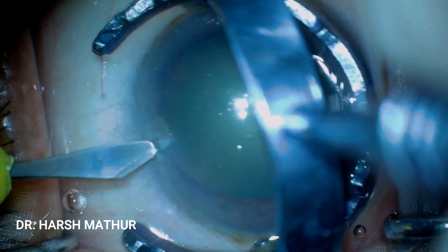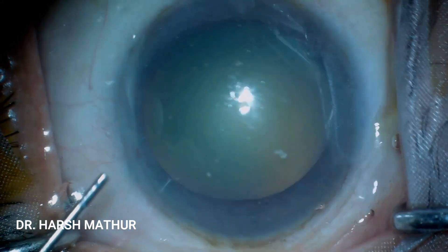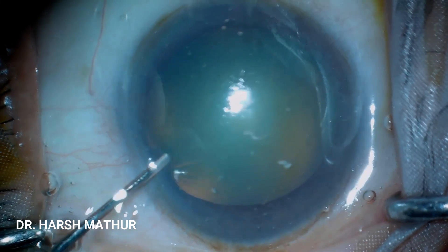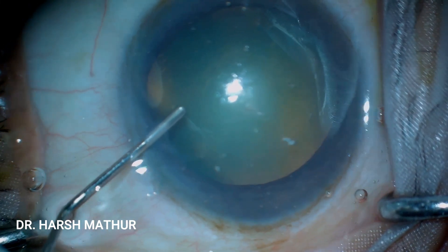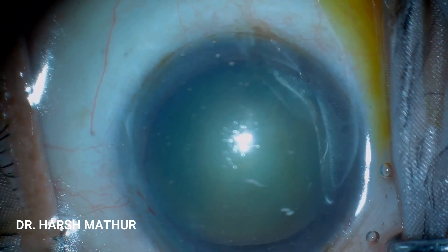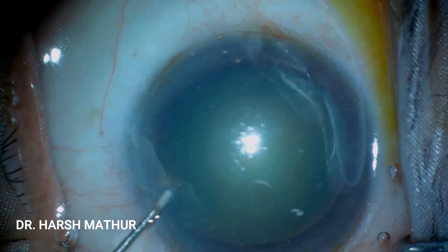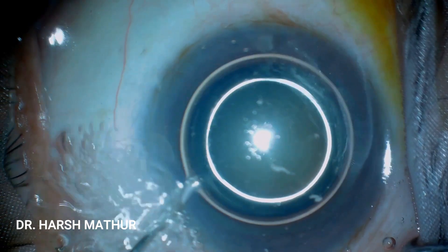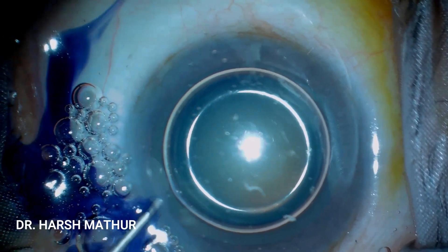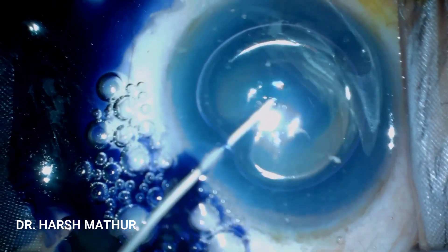It has been seen that approximately 33% of our patients need treatment of pre-existing astigmatism. Spectacle independence is the aim, and in this modern era every surgeon wants to give an emmetropic vision to his patients. The location of the incision is important as it causes the flattening of the meridian, and if we make two exactly opposite incisions over the cornea then they give an additive effect.